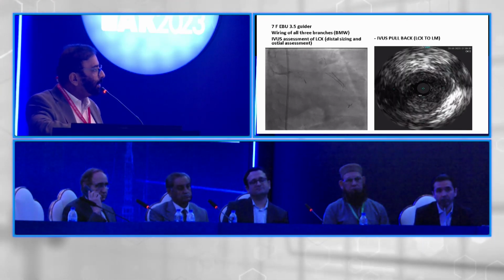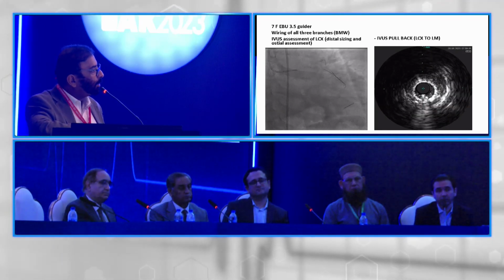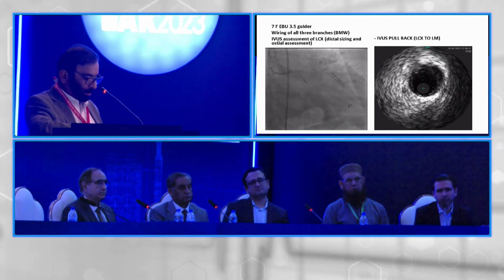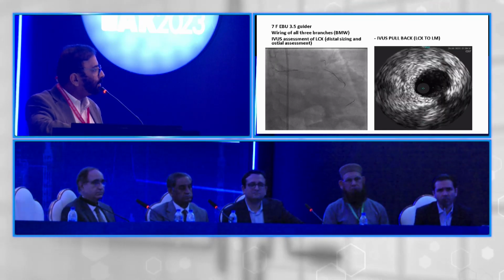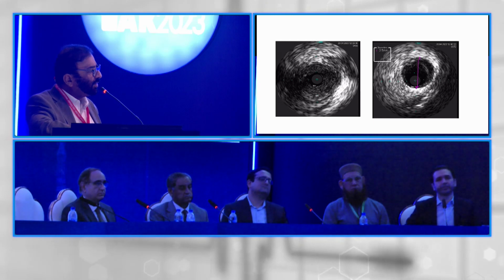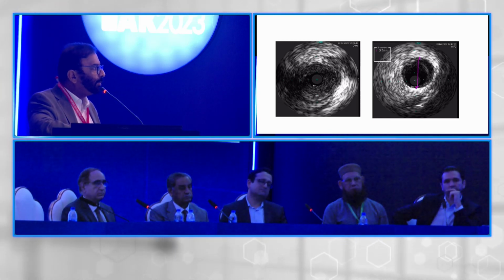Obviously, you can see the imaging. It's the IVUS catheter going into the circ, and then you can see the pullback. As it gets to the ostium, you can see a big plaque. The distal reference diameter in the circ ahead of the lesion was 3.5.